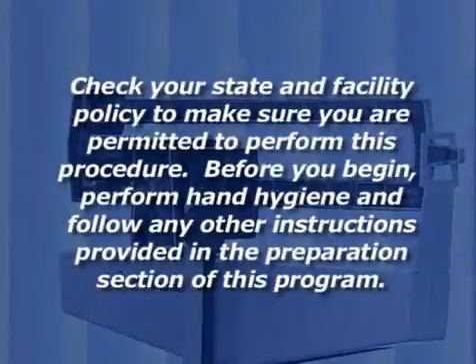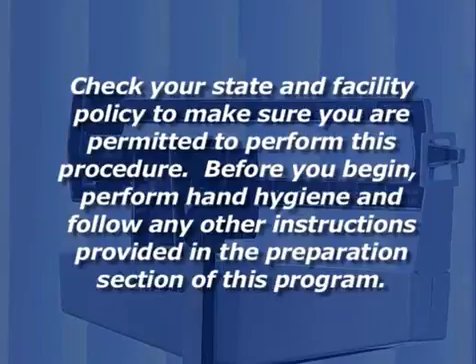Check your state and facility policy to make sure you are permitted to perform this procedure. Before you begin, perform hand hygiene and follow any other instructions provided in the preparation section of this program.